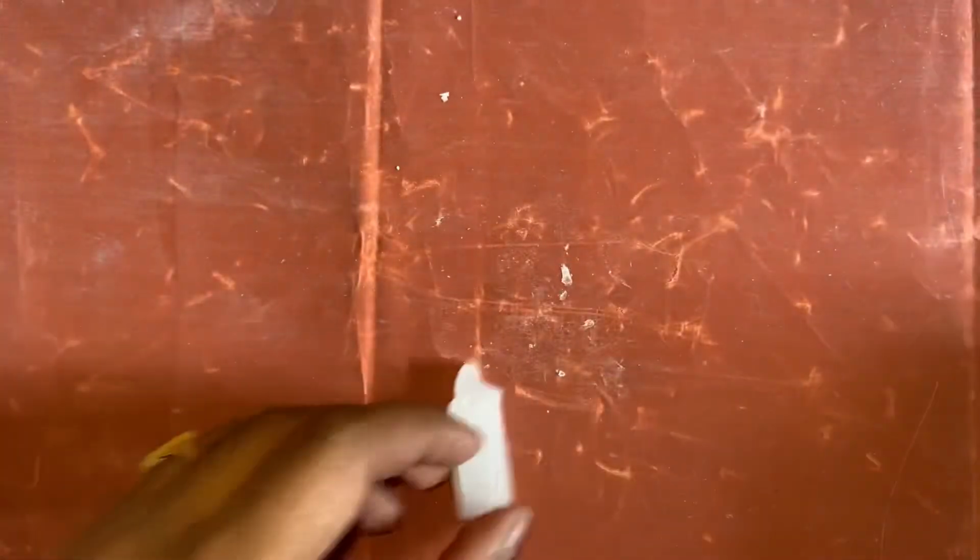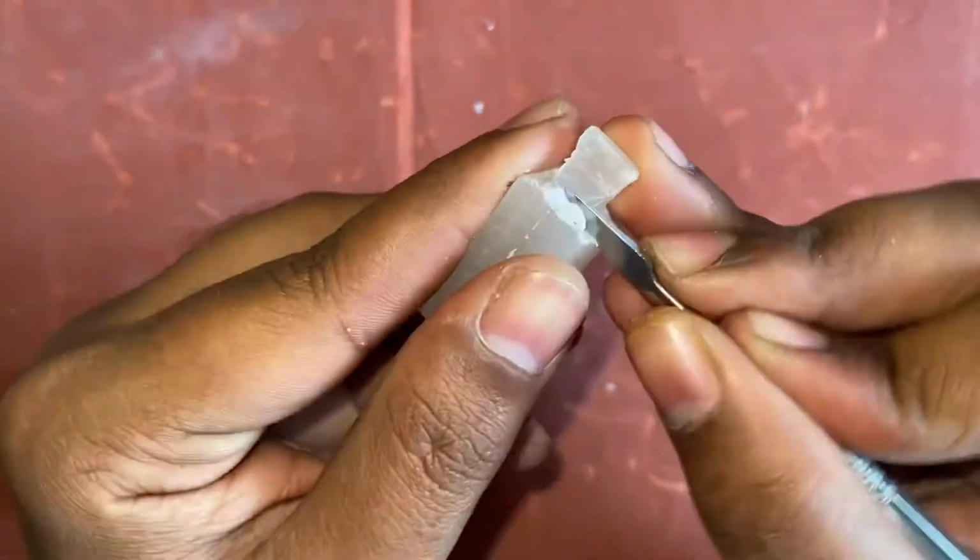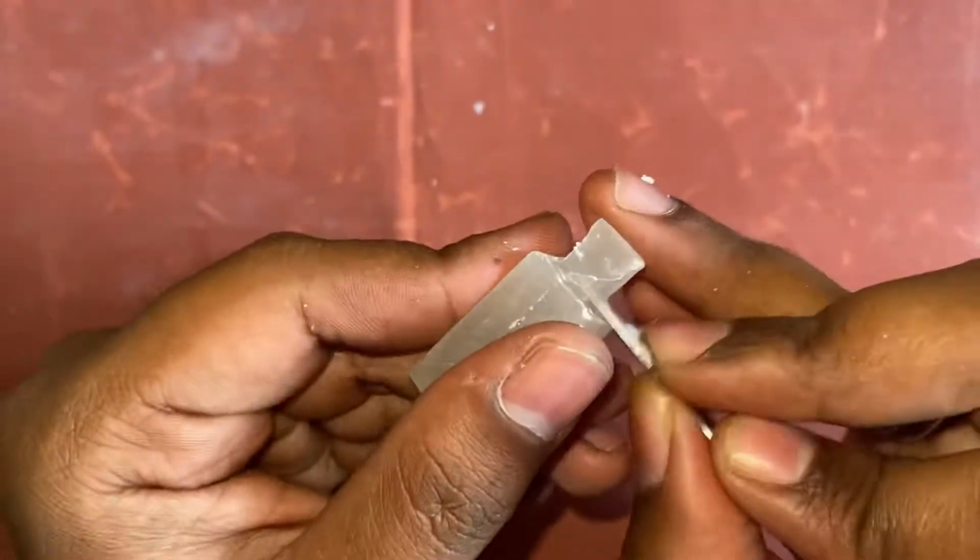Now we are removing the wax from the lingual aspect. There should be a lingual fossa in the lingual aspect.